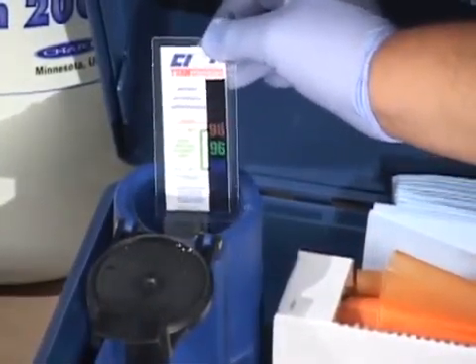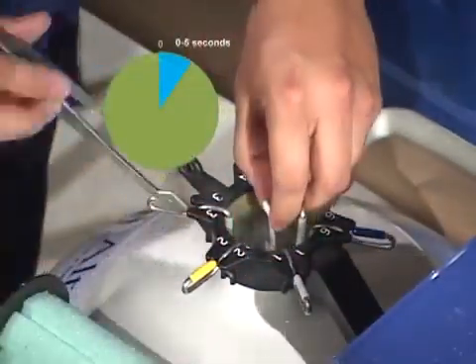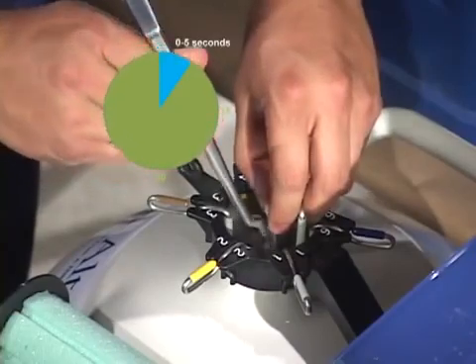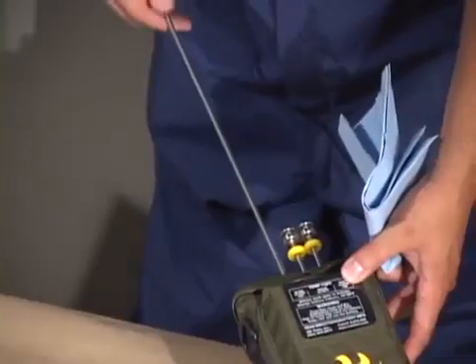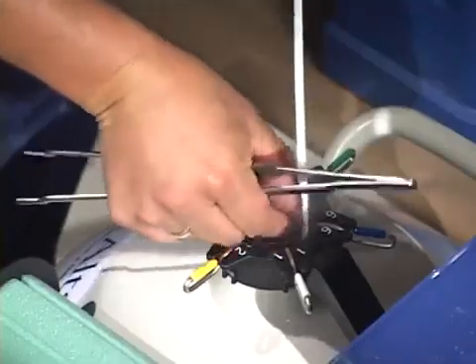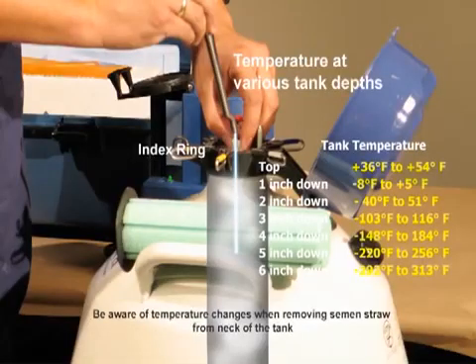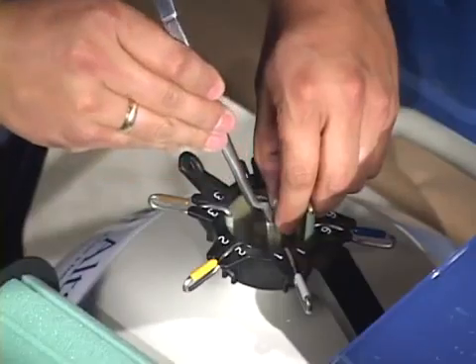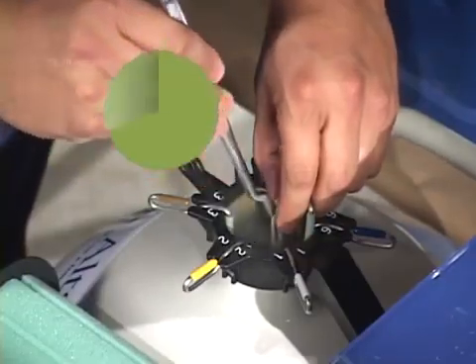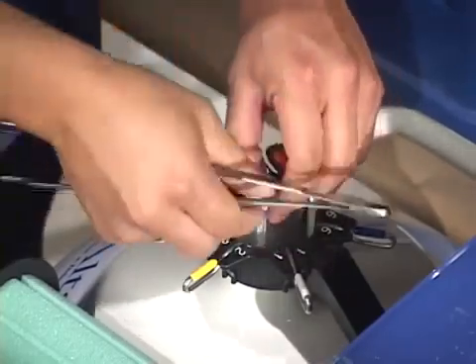Prepare the thaw unit, making sure that the thaw water is clean and between 94 and 98 degrees Fahrenheit. With the tweezers, remove the straw from the storage tank and place it immediately — taking no more than five seconds — in the thaw bath for at least 30 to 40 seconds. Do not thaw more than three straws at a time. Put the canister back inside the tank, keeping it at all times below the frost line. If it is difficult to locate or remove the straw, put the canister back and wait 15 seconds before trying again.